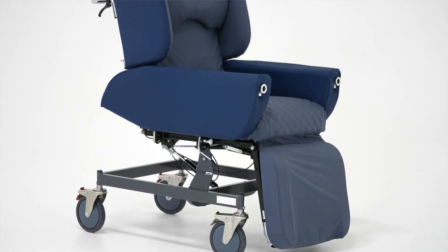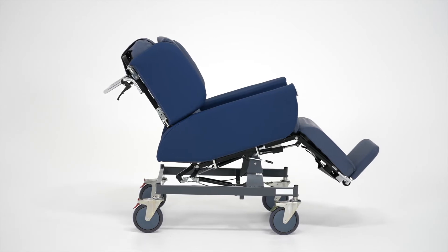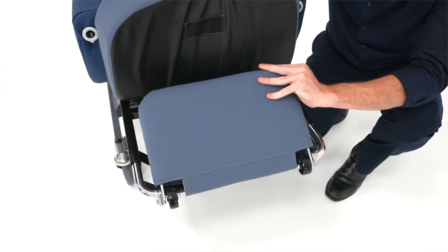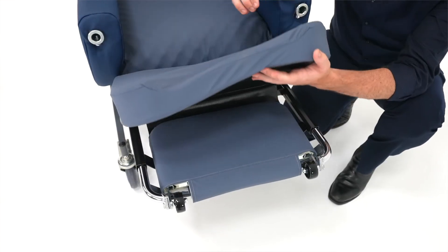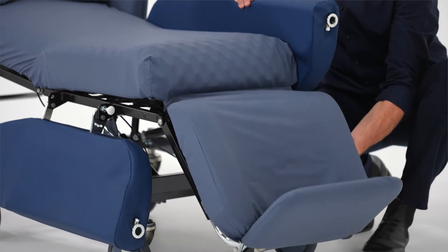The Regency is a forward transfer friendly chair with a folding footplate. It also has a leg rest that tucks back under the chair. The unique design of the non-removable footplate helps to prevent the user from sliding forward in the chair, lowering the number of repositions required.